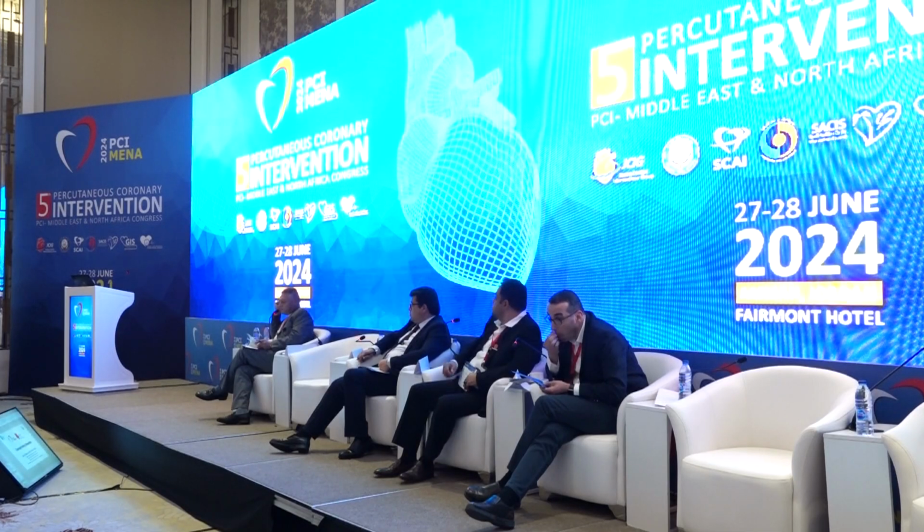And the message that Dr. Suradi said: do not panic, anticoagulate. When that Burr is stuck, anticoagulate, vasodilate, and call for help. Any questions?